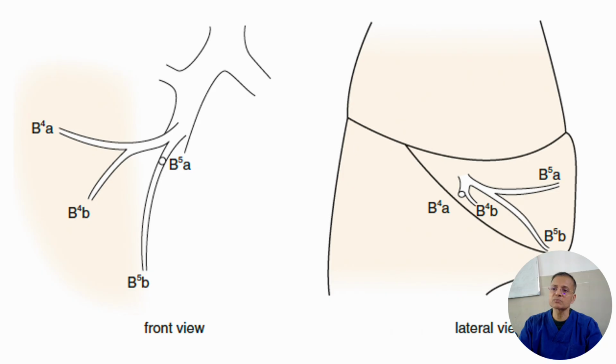From here the middle lobe bronchus is coming, and here we can see the lateral segment is B4 and the medial segment is B5, and these will divide further. B4 is, but it's the frontal picture, right? So this is the lateral part, B4A, and the middle part will be B4B, the subdivisions. In the B5, we have the superior and inferior. Superior because it's rounded, because the axial image is taken, so you cannot visualize towards the upper side. So this is B5A, and B5 superior and inferior, right?